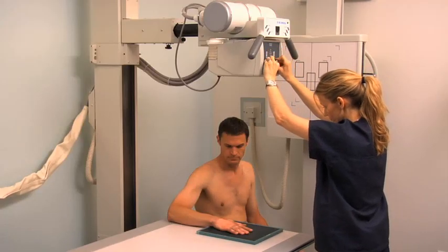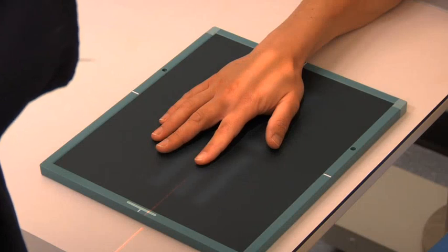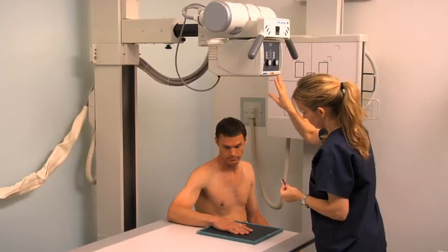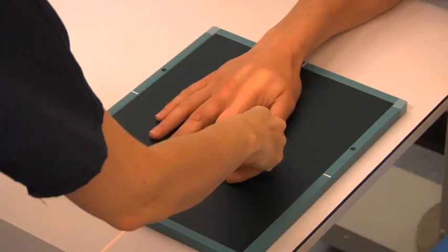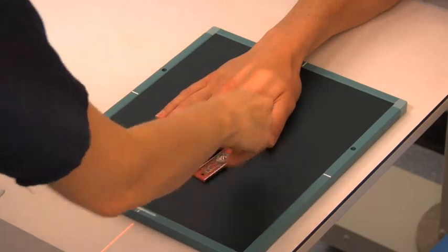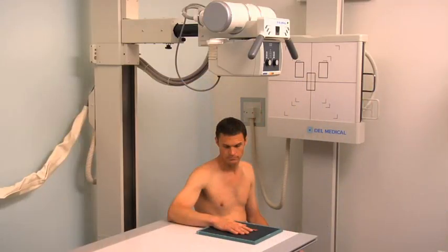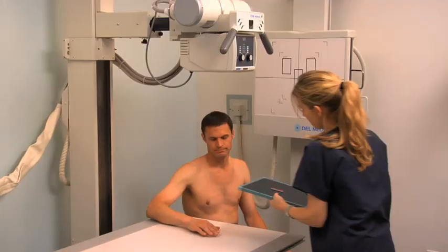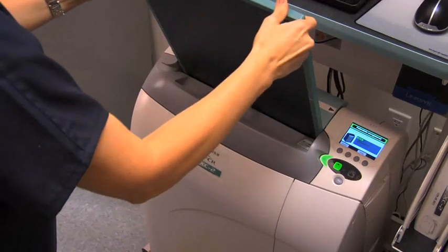Collimate the light field to include the phalanges, the metacarpal-phalangeal (MCP) joint, and the distal metacarpal of the affected finger. Position the right lead marker within the light field. Move behind the protective lead barrier. Check that the exposure factors are appropriate for the patient and, if necessary, make any adjustments. Expose the cassette by pressing the prep button and, when ready, press the exposure button. Remove the cassette and process it while preparing for the next projection.